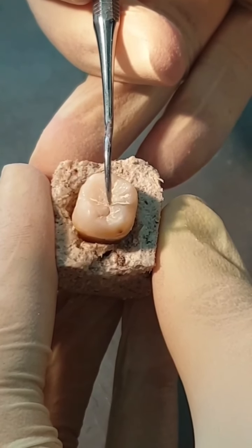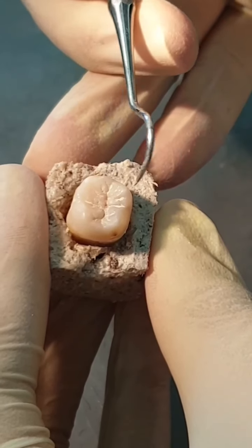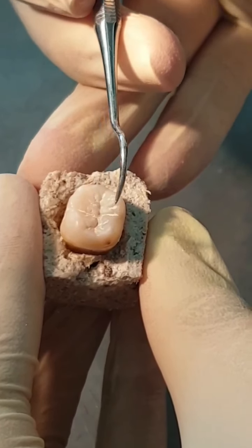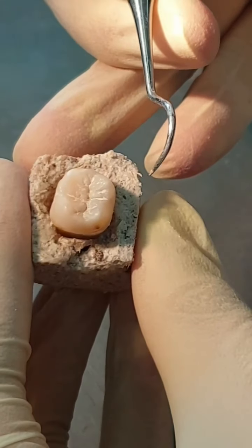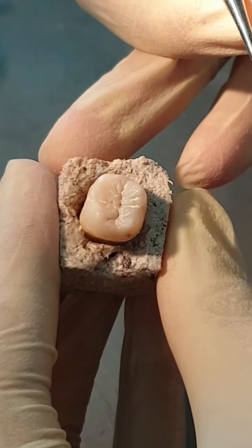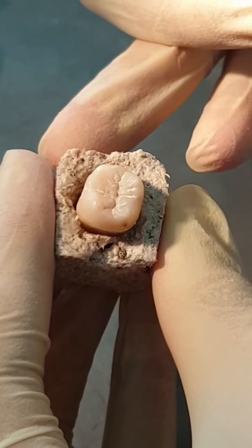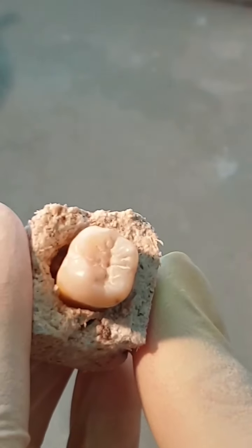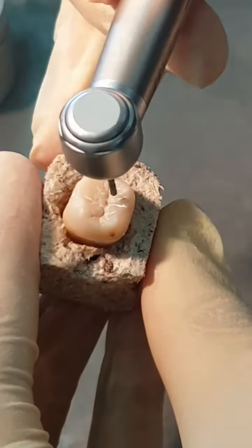We try to find the largest orifice first, and in this tooth, the largest orifice is the distal orifice. In distal root, we can have more than one canal. And in this case, we are going to look at some landmarks that I'm going to show you at the end of the video to guide us to find how many orifices we have in distal root. Our initial outline will be ovoid form, but our final outline will be trapezoidal or rectangular in this case. Let's begin our preparation.